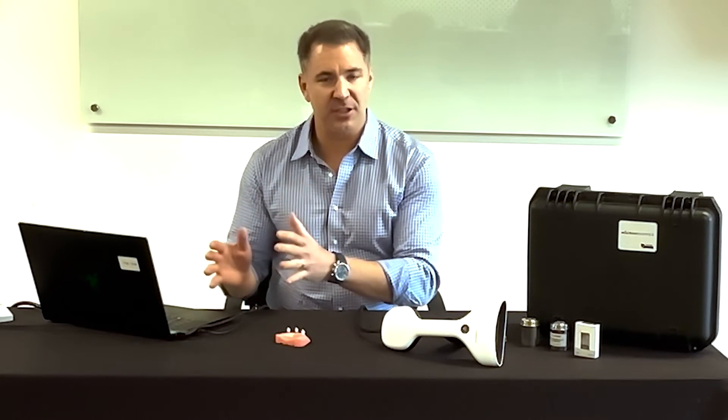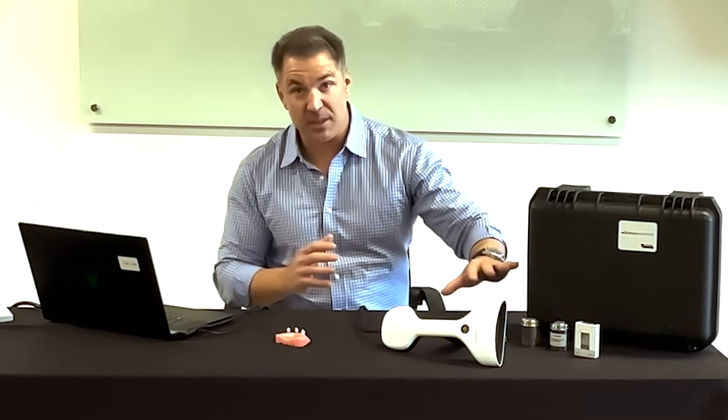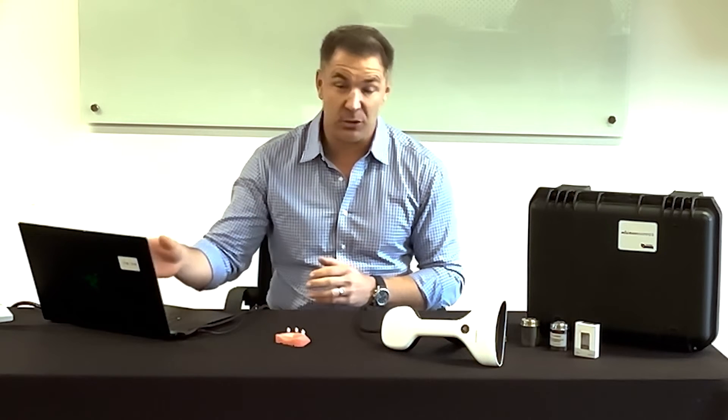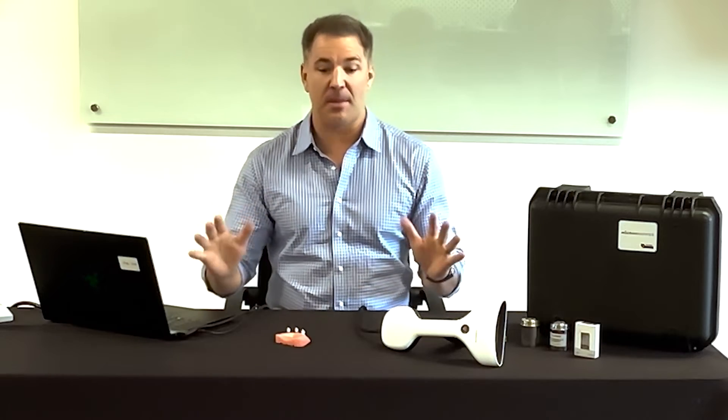A couple of things we want to cover: some features, some of the benefits, and answer questions about specific things on the scan bodies and what comes with the Micron Mapper. I'll also go into a quick demonstration with the software. First off, what comes with the Micron Mapper?